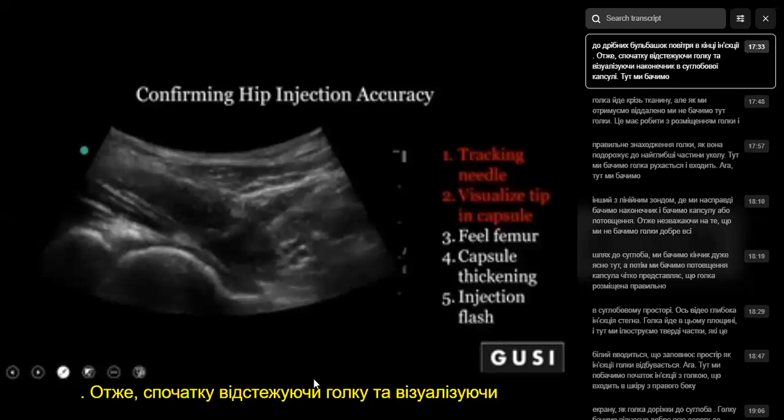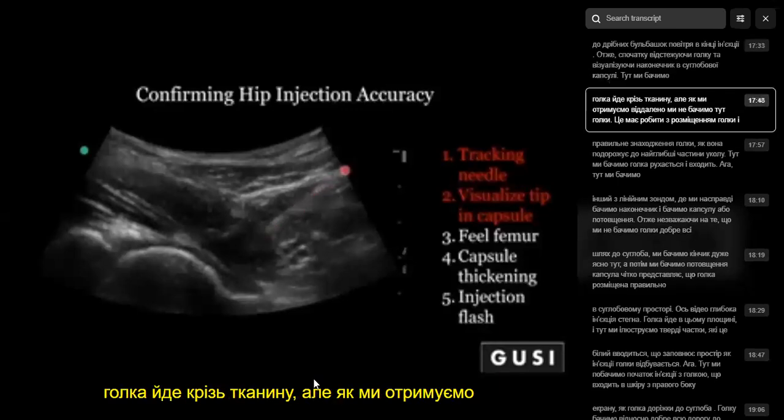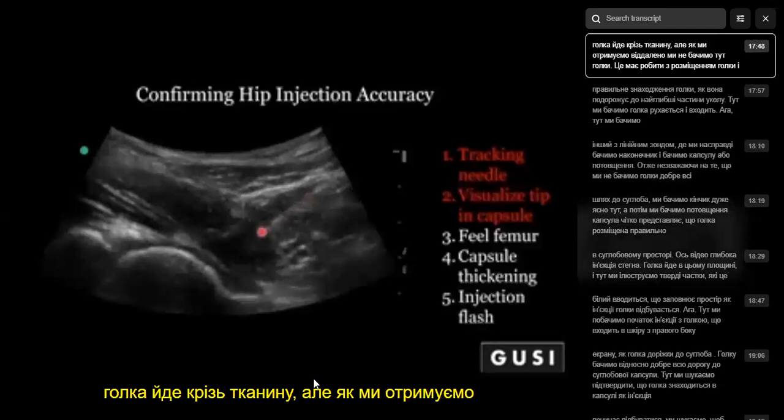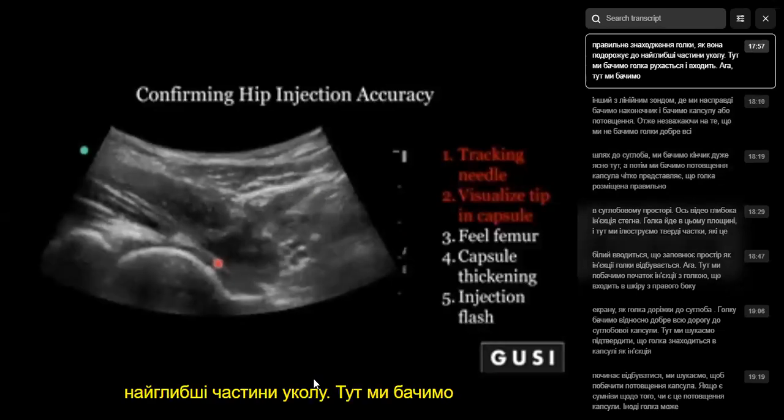So first off, tracking the needle and visualizing the tip in the joint capsule. Here we see the needle coming through the tissue, but as we get distally, we don't see the needle here. This has to do with the placement of the needle and the correct finding of the needle as it travels to the deepest parts of the injection.